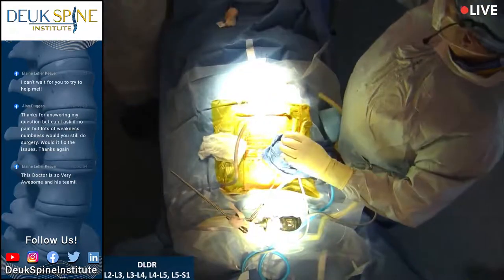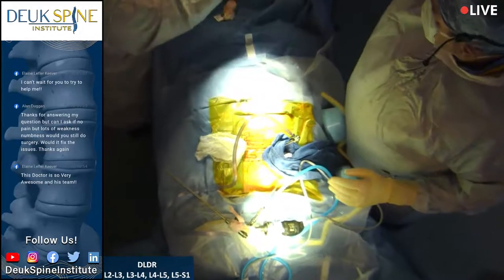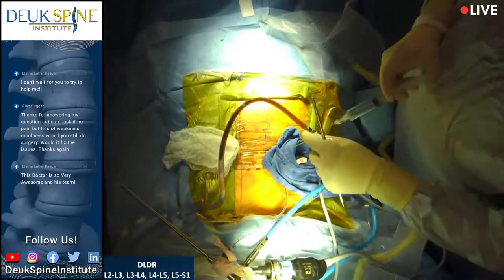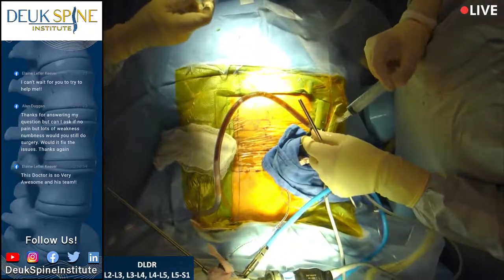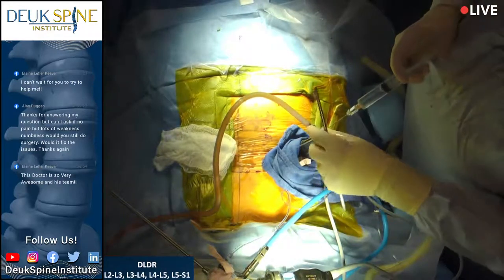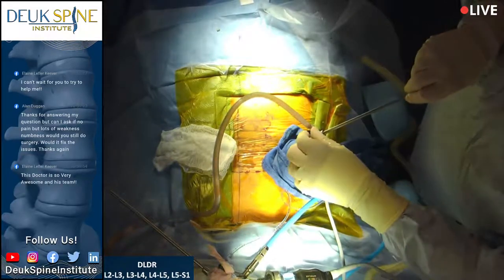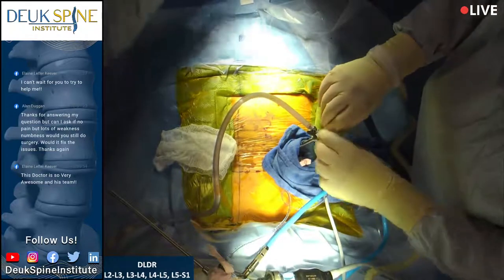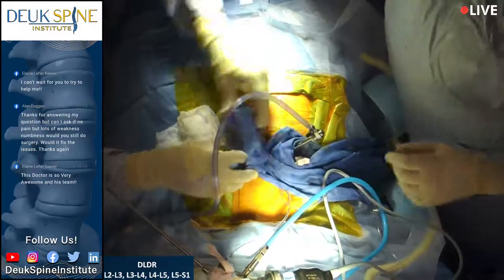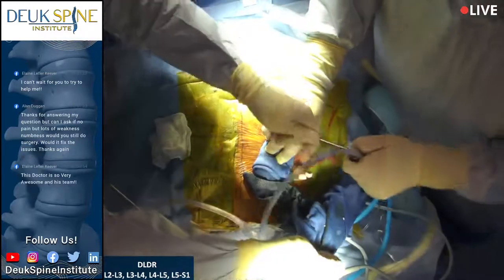Off scope. Okay, we're going to put a little antiseptic and we're going to clean this out. Give me the irrigation. I don't put that much, Luis, anymore. I just put a few drops in there because you don't need a whole syringe full. So we're done with two discs. We're going to do our third one next. And Luis is going to tell me which one.